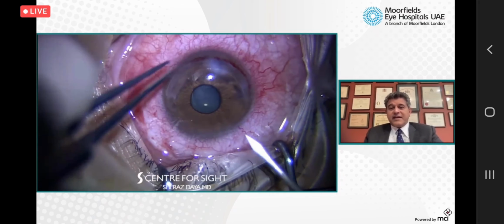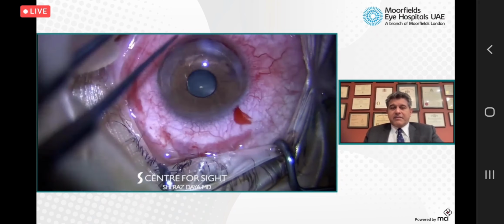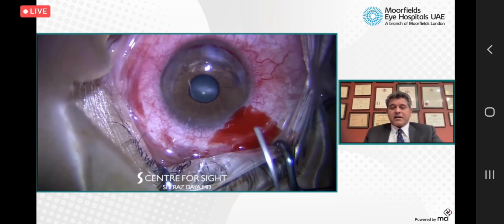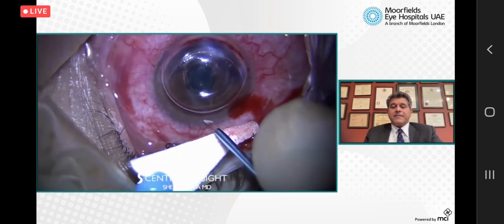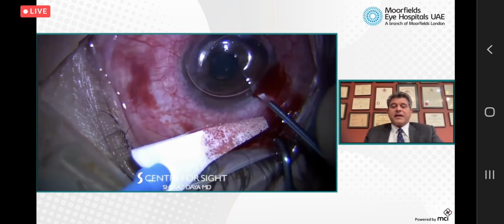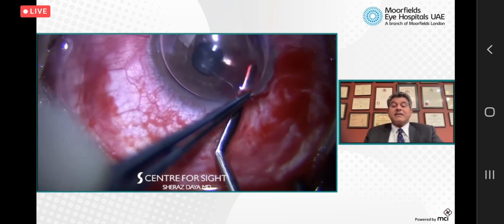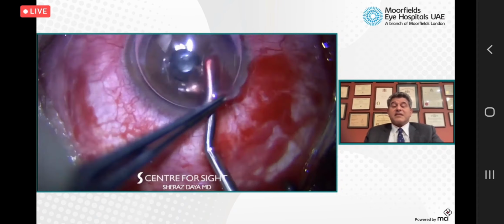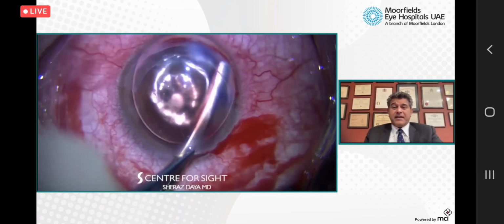And you can see this. You can see that there. The vessels have bled. I'm making a paracentesis. It looks a bit like a stuck record here, injecting air into the anterior chamber. And I'm using a freehand diamond there. And here I'm again dissecting that cornea. And this is a speeded up video. I'm not that crazy. This is a very delicate cornea here.